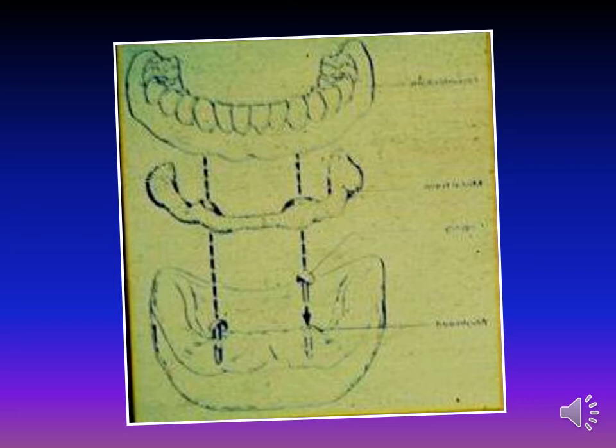The size of the primary coping may be short or long, and may be designed to provide support only or to provide both support and retention. The secondary coping or sleeve may be a special metal thimble or porcelain fused to metal restoration, fitted over the primary coping and located at the tissue side of the acrylic denture base.